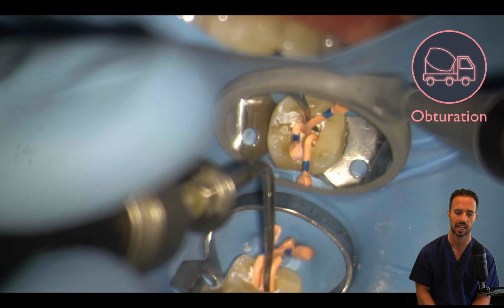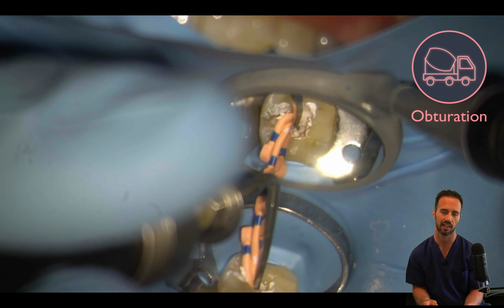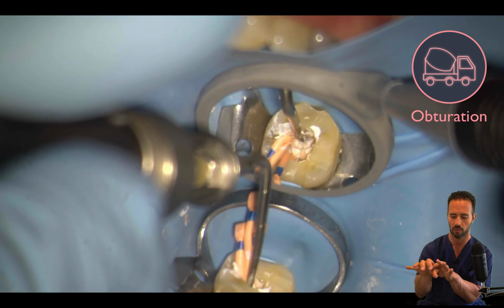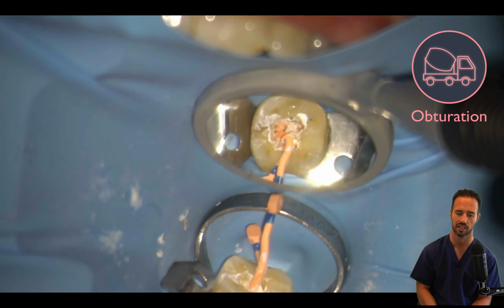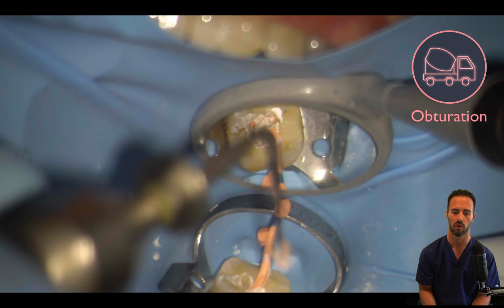Just be careful to not accidentally pull out cones from adjacent canals because the heat tip, if it's warm enough, will melt some of the gutta-percha and actually pull out a cone. So make sure you're being very, very precise as to where you're introducing the heat tip, so that you can do this obturation all at once, okay?